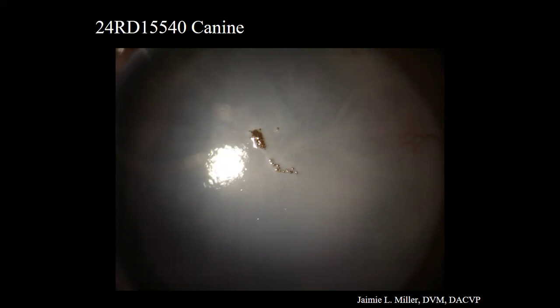What we're looking at here is the cornea from a 7-year-old female spayed Bichon Frise that comes with a history of being diagnosed with bilateral keratoconjunctivitis sicca and progressive retinal atrophy.